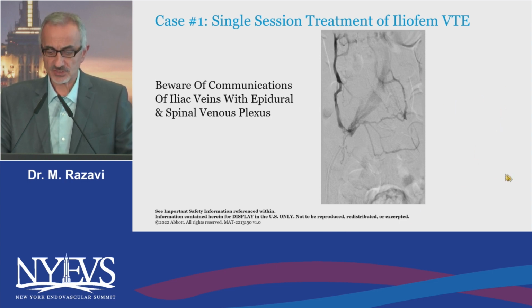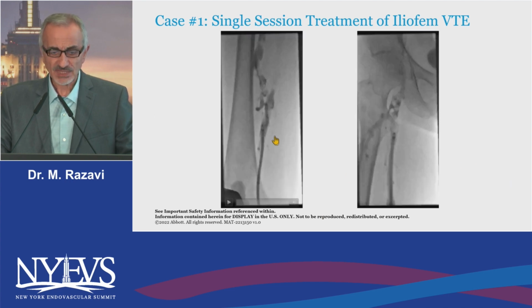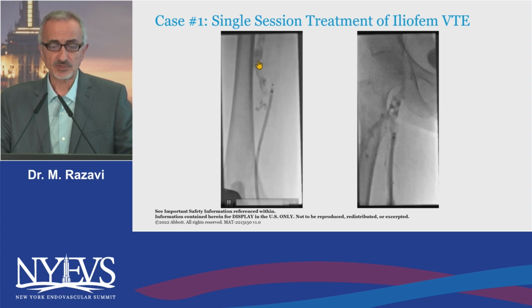So now everything is clotted in this lady. Here's a live case that we're going to show you. The system is in, as you can see now in the venous system. Since we're coming from the pop and in the direction of valves, I don't use a wire. We take the wire out, so that increases the aspiration power of the system. And here it is. You can turn it on, and immediately you can see clot just pulled in. Even the clot from the parallel vein is being pulled in. You can see all the clot is sitting up here and into the profunda, with typical radiologic features of a fresh clot.